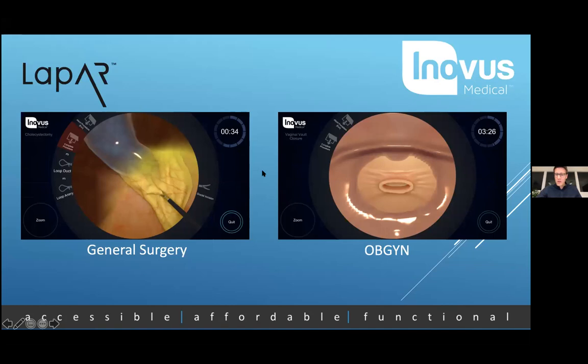I've got another question from one of our partners there from NASCO Healthcare. Thank you, Rush. The question here is, can we see an image of a surgical model? Rush, the best thing to do is it's on the screen here. The surgical model is what that instrument is holding on to. And it's on the screen with the vaginal vault, just with the digital overlay. I won't go through the rigmarole of pulling up another image, but if anyone would like to visit our website, you'll see some digital renders of them there.